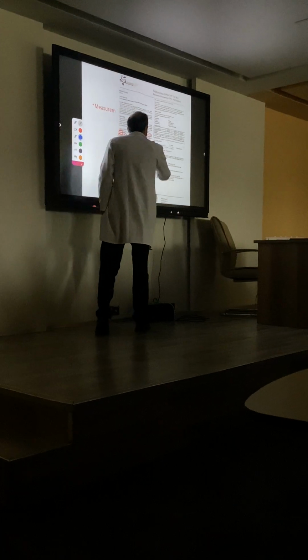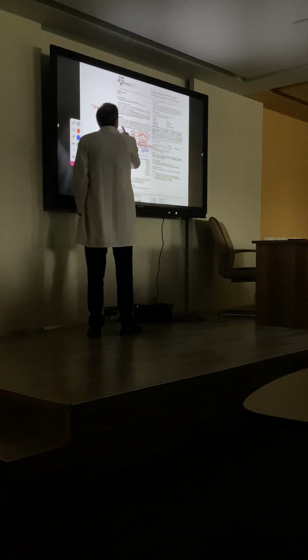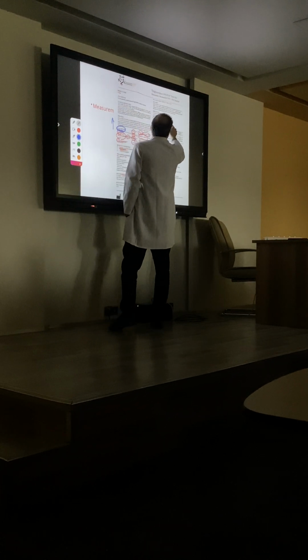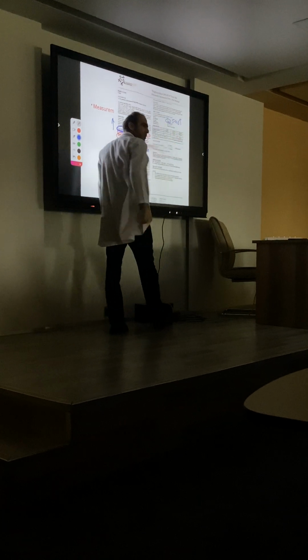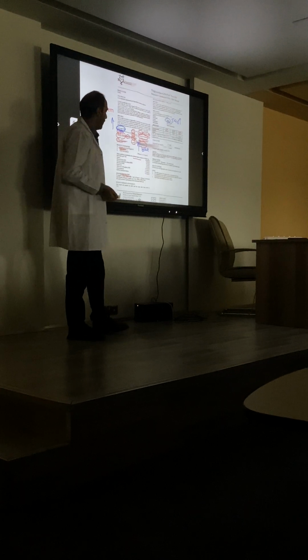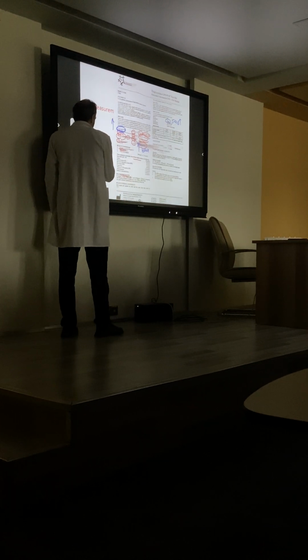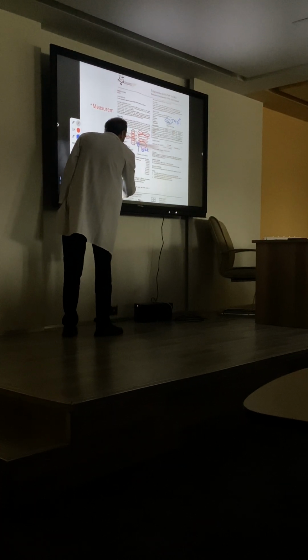So the intensity of the blue color is equal to the amount of triglyceride. If triglyceride is high, the intensity of color is high, and the absorbance at 546 is high. So that is the basis of the reaction. And we have reagent number 1 and reagent number 2. My colleague prepared one part of reagent number 1 with 100 parts of reagent number 2.